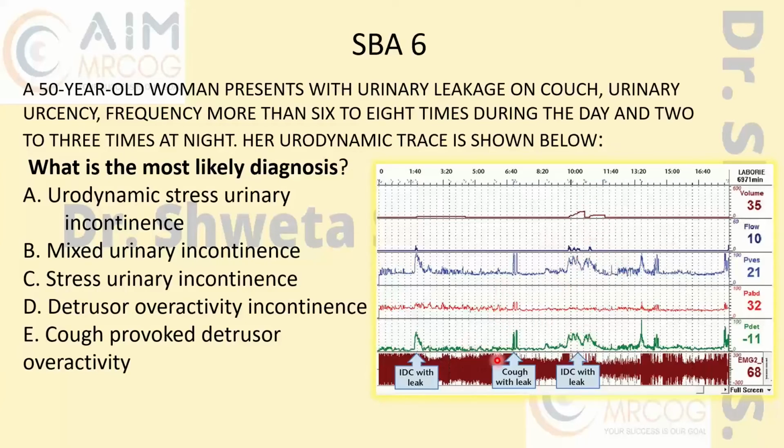Yes, you're right. And what about this cough with leak and no detrusor overactivity here? Cough with leak. So that is stress. So what will be your diagnosis? Mixed. Yes. Usually they will not give you all this written. I have just put it so that sometimes they will make the graph like this. So you have to understand that if both cough with leak without detrusor contraction and idiopathic detrusor contraction with leak are given, you will make the diagnosis of mixed.